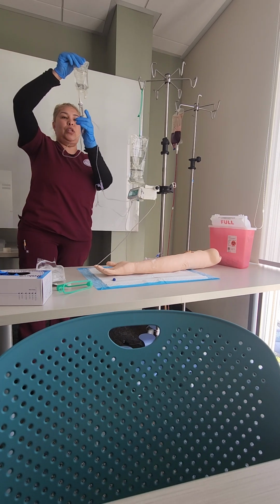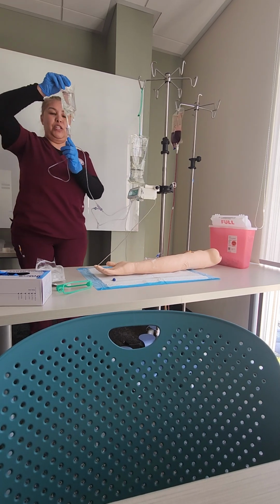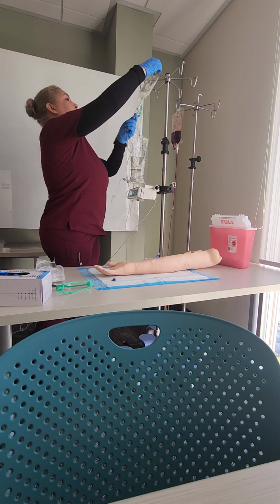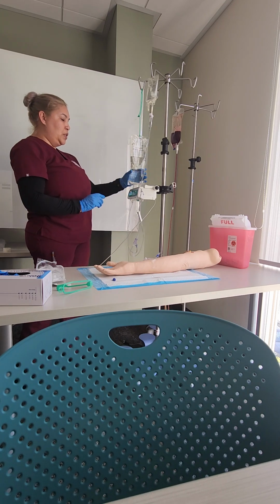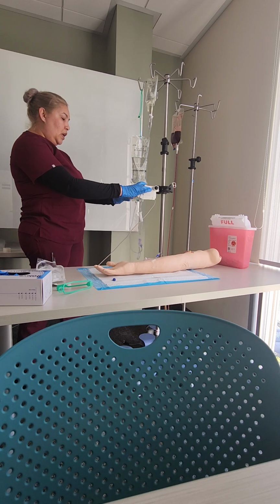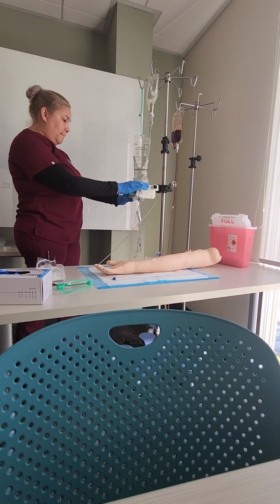And I want to make sure that I have fluid in my chamber, but I can also see the drip. So like I mentioned, I want this to go up higher. And my machine is just beeping because it's asking me to hurry up. What I want to do now is silence the alarm for now, and I'm going to ask to set rates for my secondary.